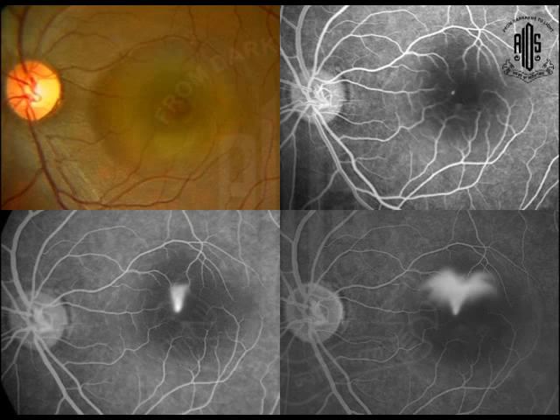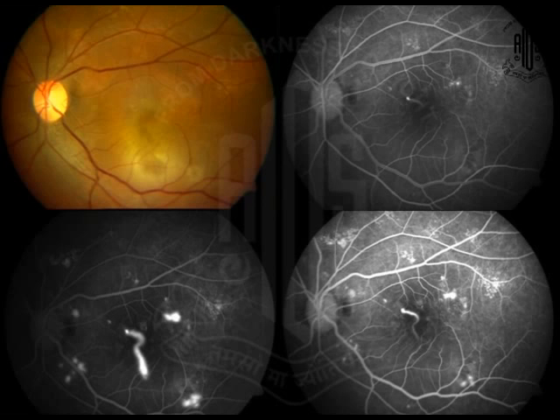This is one typical smokestack pattern. You can see here. And then this is one of the reverse smokestack. This is due to the fibrin deposition, which is forcing the dye going downwards.